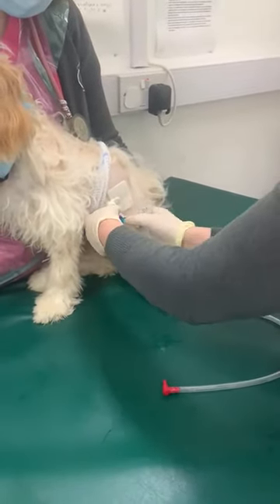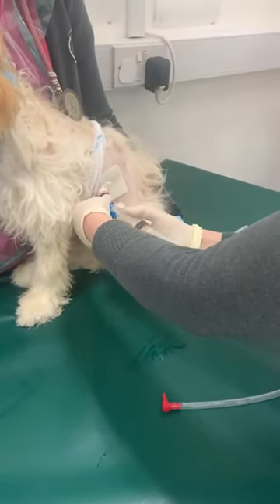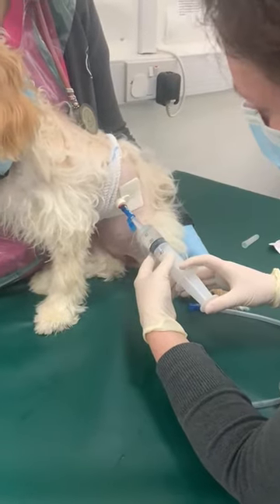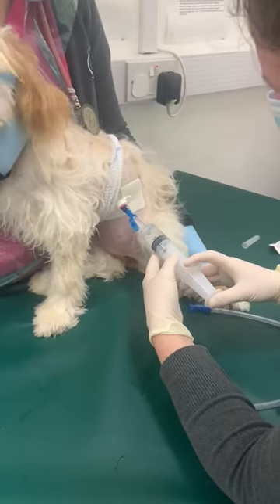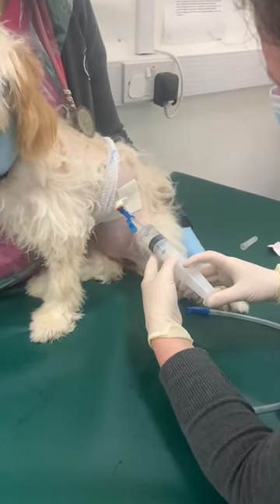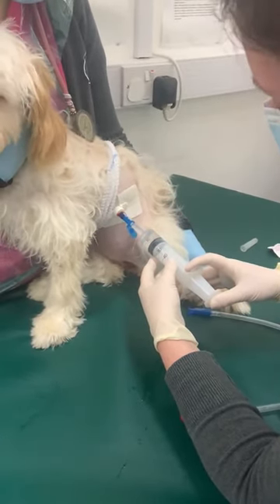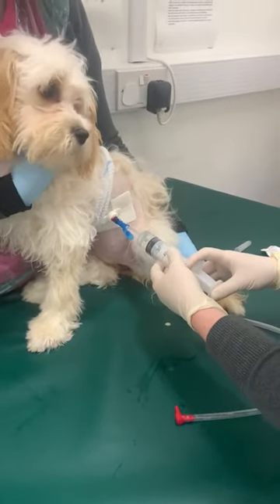Get your tube ready and open it up. You might get a little bit of content that comes back, so just have your syringe as ready as possible. Then very slowly start to give the feed or the water — this is just water going down at the moment. Very gently, nice and slow, keeping an eye on your patient for any signs of discomfort or nausea. If they're licking their lips or get a bit restless, just stop.